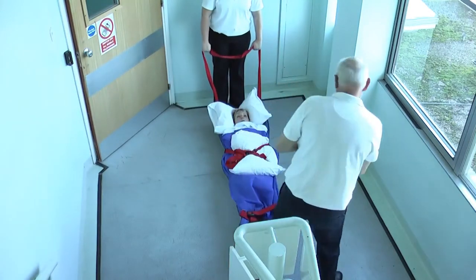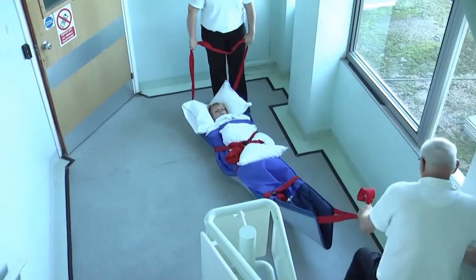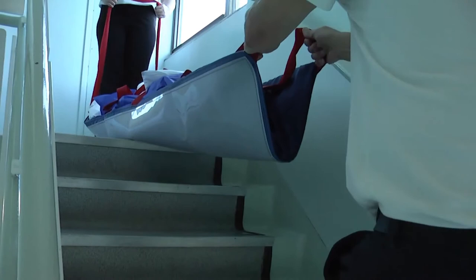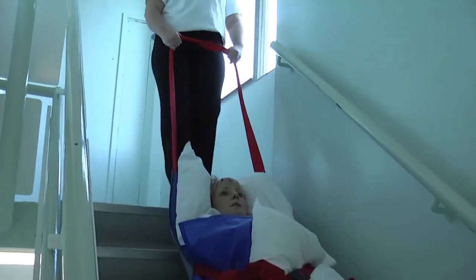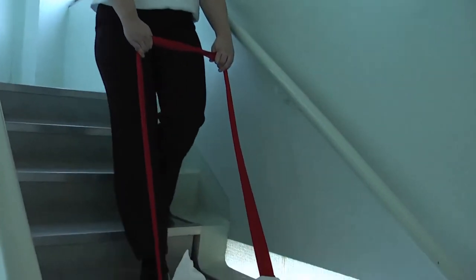With one person at each end of the ski slide pad, the user can be securely moved down the stairs. It's very important that the person at the foot end keeps the ski slide pad as straight as possible until the upper part of the body has come over the top step. This helps to prevent excessive bending of the user's hip and pelvic area. Once the weight ratio changes, let the foot end come into contact with the stairs. The operator at the head end should keep the pulling strap long and assist by slightly raising the handle as the body moves over the top step.